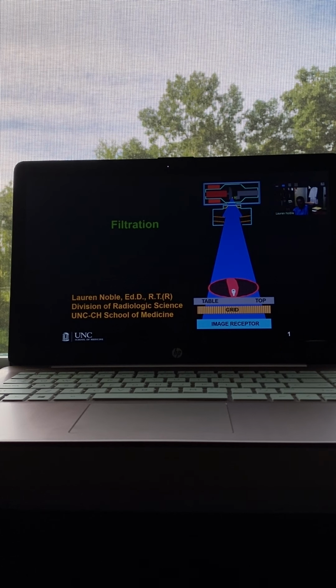So the thorium helps to reduce some of that vaporization, but it's still going to happen. And the downside of that vaporization is during an X-ray exposure, electrons that come off that filament will be drawn to that metal inside of the glass housing instead of making it to the anode. And so we lose out on X-ray production. It reduces the efficiency of X-ray production. So as a tube ages, that's just something that will naturally occur. So we've got that filament and we've got the focusing cup. And then those electrons will hit the anode.